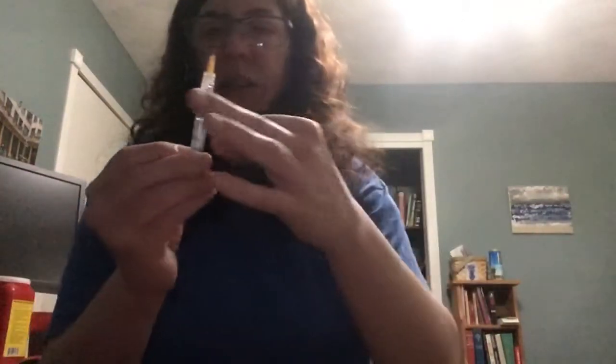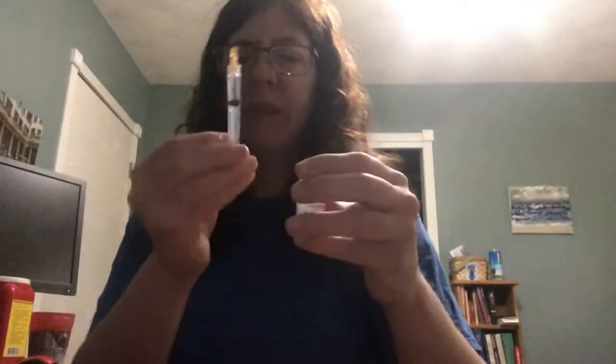And should be most of it. Now we can throw that one away. Flick it a bit on the side. Press out as much of the air as you can. So you just have the full milliliter, or however much you pull out of insulin.